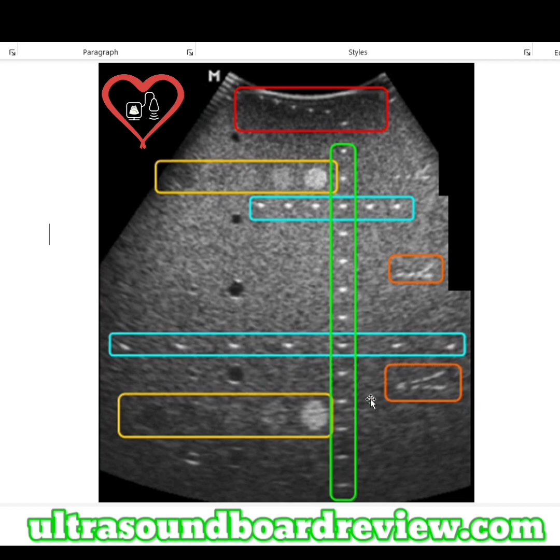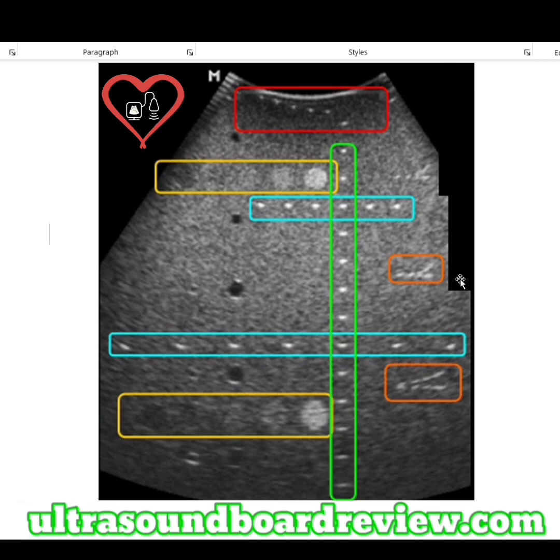A lot of people will think that lateral resolution is evaluated right here, the pin circled in blue, but that would be incorrect because this is the horizontal registration, and these evaluate the position or location of each pin going across the sector. But lateral resolution is evaluated right here in orange. But that's not the only resolution that's evaluated right here. Axial resolution is also evaluated here.